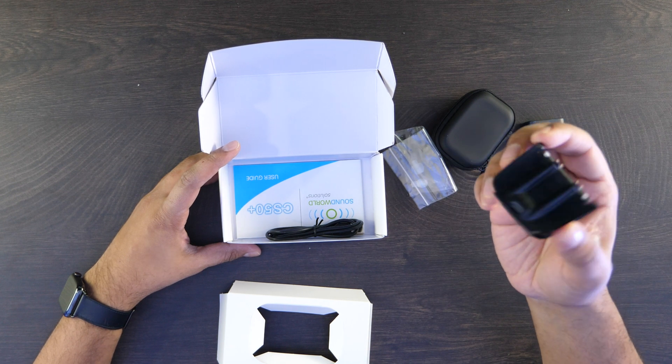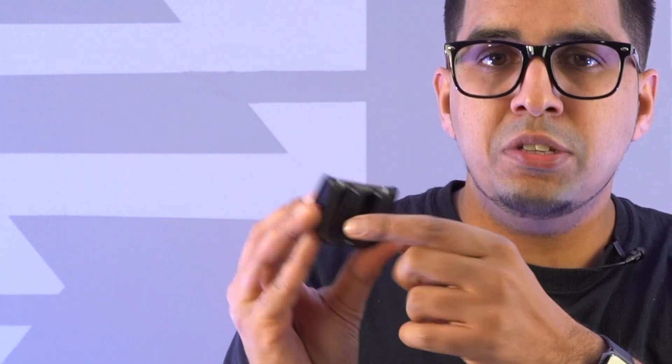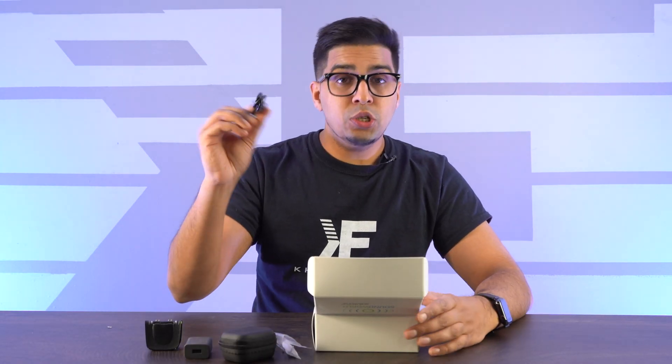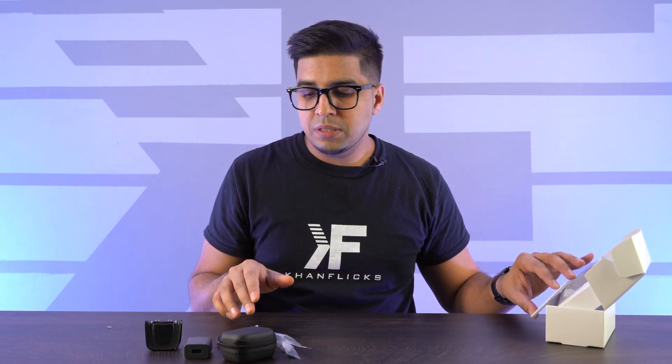This here looks like a standing charger — I have not seen this before. So you don't have to plug it directly in; all you have to do is plug the cable into this unit and then rest your hearing aid on top to charge it. It also comes with a USB-C to USB cable for charging, and lastly you get a user manual. The nice thing is you can use it for audio needs — listen to music, change between different modes. There are different variations of settings, so it's fully adjustable.